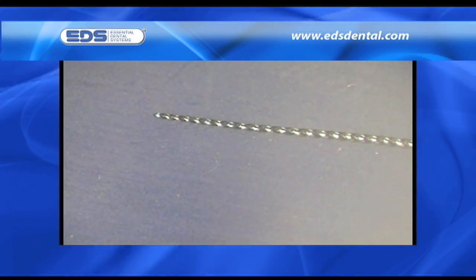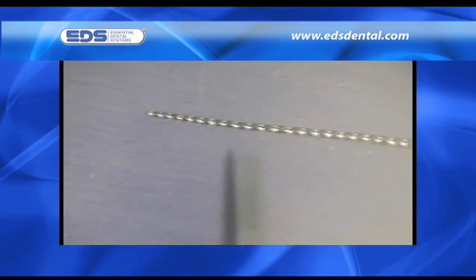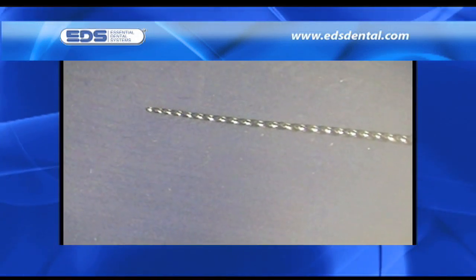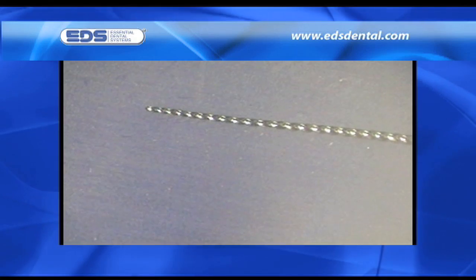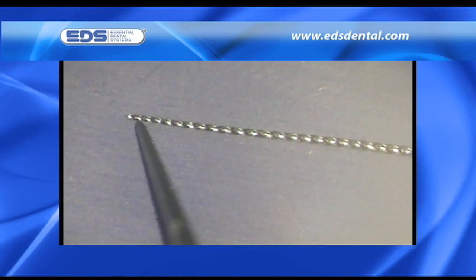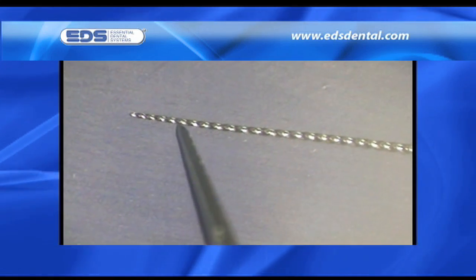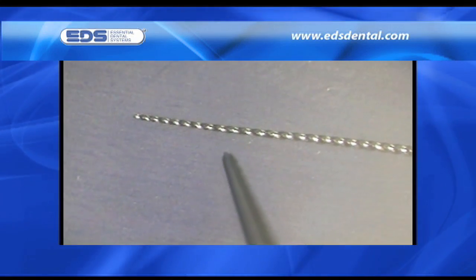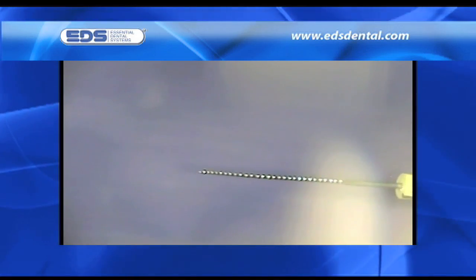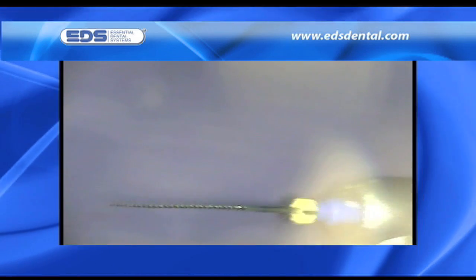K-Files are generally used in a watch-winding or back-and-forth motion with some degree of apical pressure applied. Note that the cutting portion of the K-File is 16 mm in length with 30 flutes along its length. With such a high number of flutes concentrated into 16 mm of working length, the flutes have a significant horizontal orientation. When used with either a manual watch-winding stroke or in a 30-degree reciprocating handpiece, the K-File is moving in a predominantly horizontal plane.